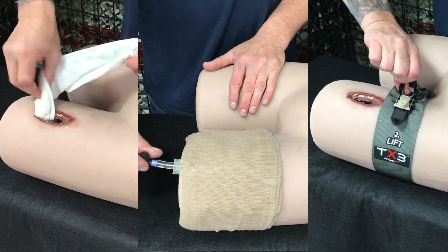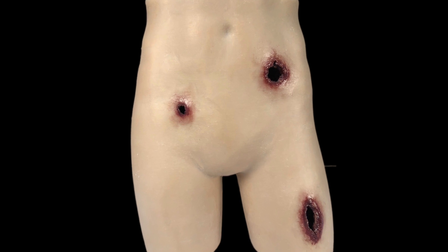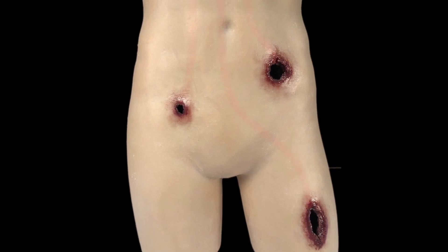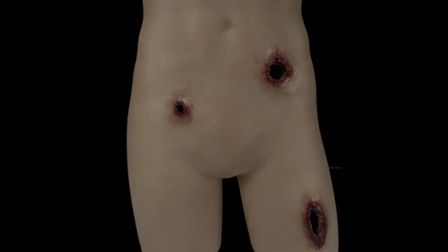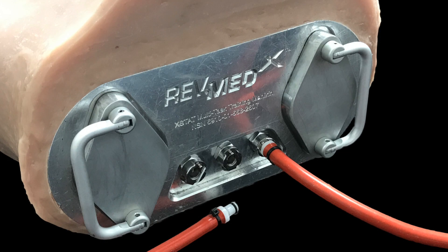For training convenience, all the wounds are located on the interior side of the mannequin. All the wounds include synthetic arteries, which can add realistic bleeding to each wound. The arteries are also designed to occlude blood flow when tourniquets and junctional devices are properly applied. These simulated arteries are accessed by three quick connect adapters located on the top of the mannequin.